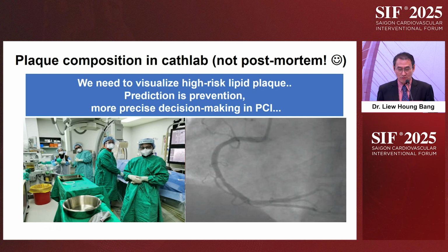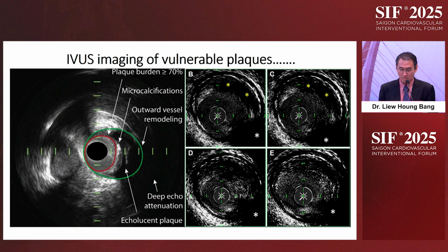The plaque composition for us, we need to know with our patient. We need to visualize high-risk plaque. If we can predict, we can prevent. And of course, it can help us make better decisions in the cath lab.